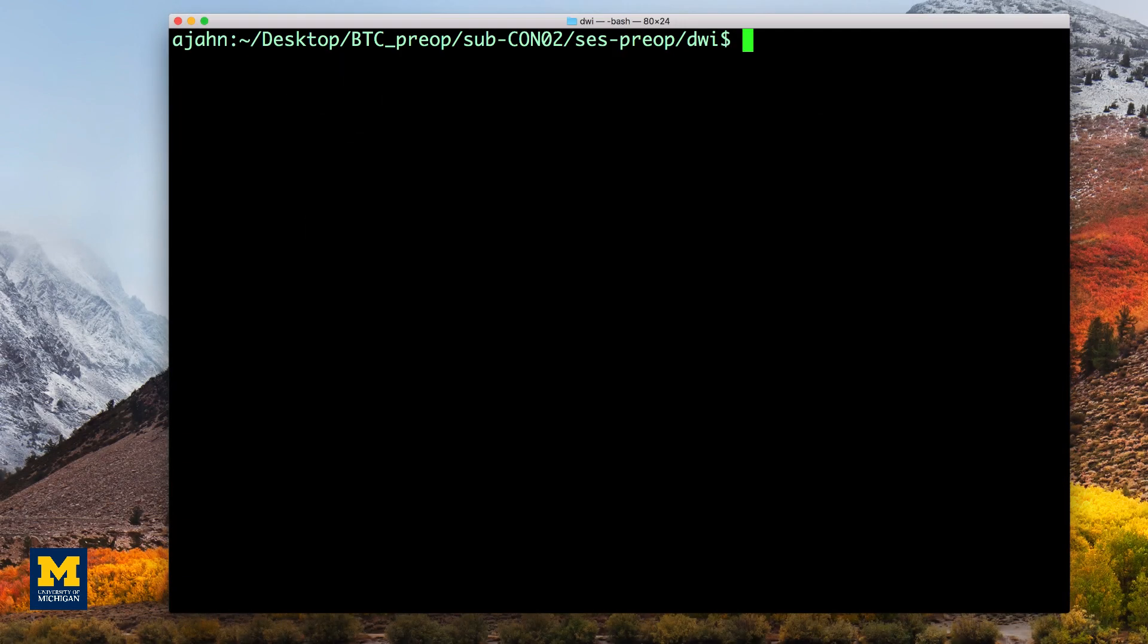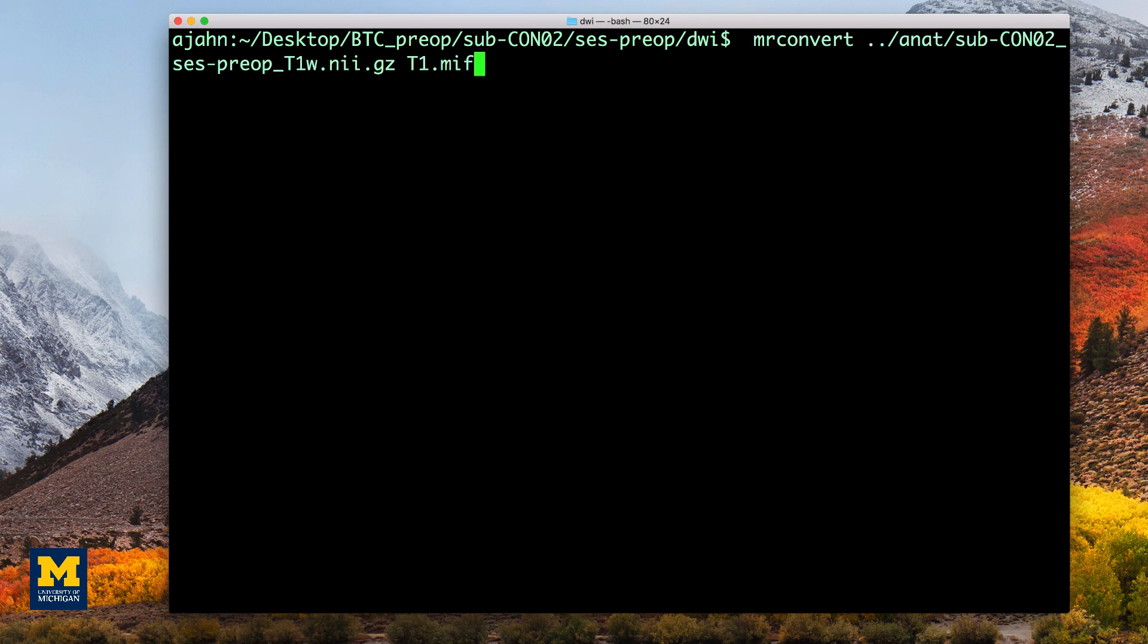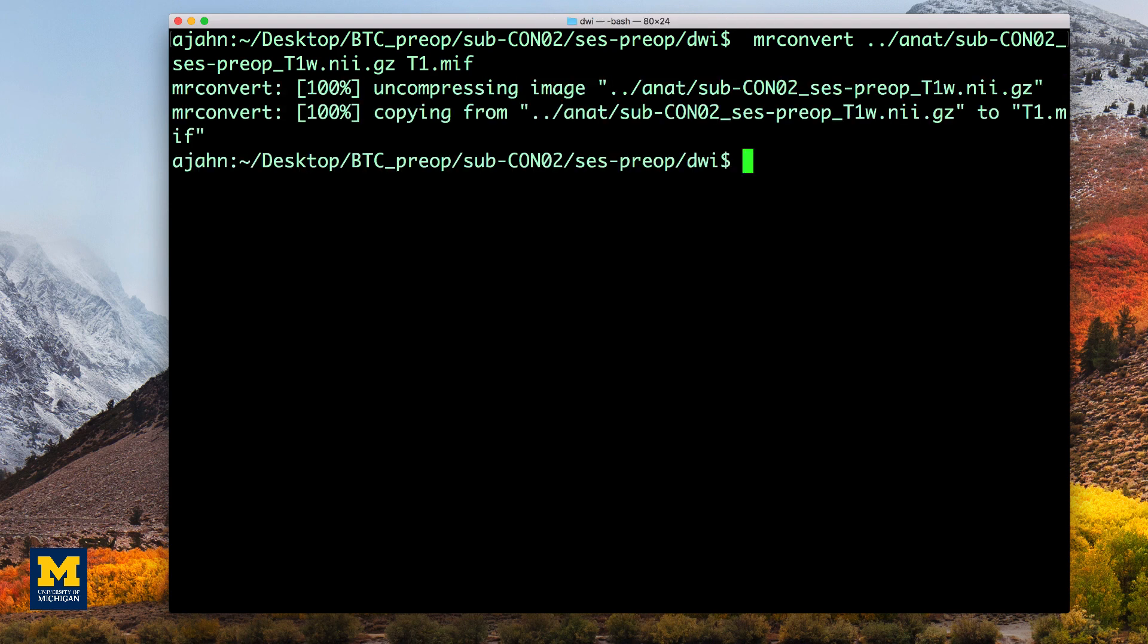We need to first convert the anatomical image to MRTRIX format. Just as in the previous tutorials, we will use the mrconvert command to convert the anatomical image in the directory to a file in the current directory called t1.mif.